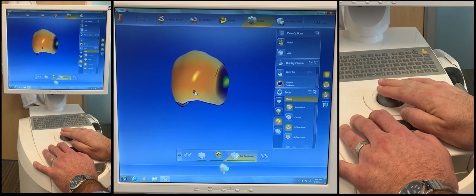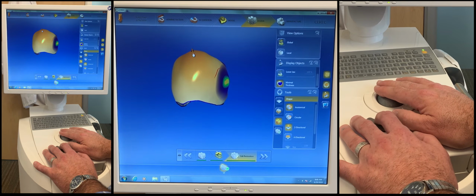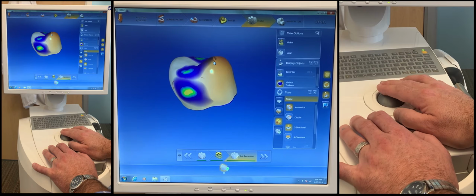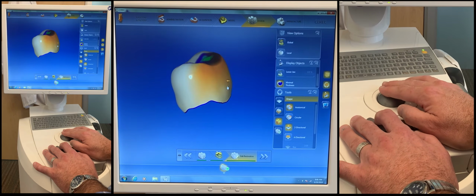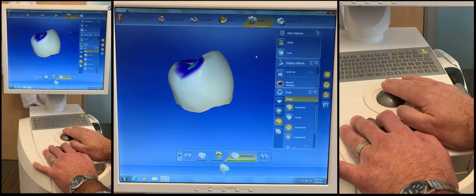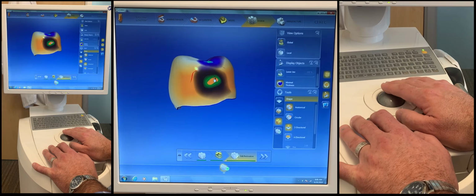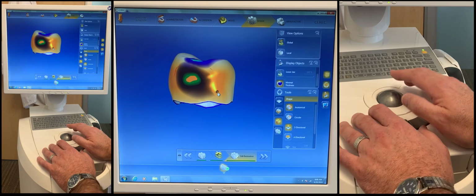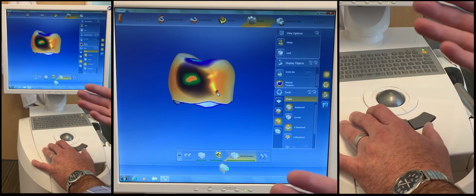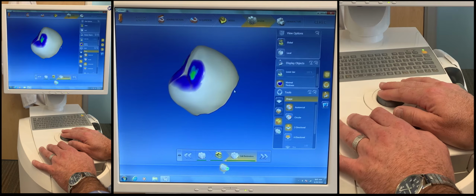And if I go over here, it's the buccal, and here's the incisal portion of the buccal. Here's the facial cusp, the lingual cusp, down on the buccal, distal. So basically this allows me to select regions of the tooth. And many people like to use this. It is very, very simple. Honestly, this tool is probably, for most of us, a little more useful and more often used than that circular shape tool. I've just fallen into that habit and used it forever.